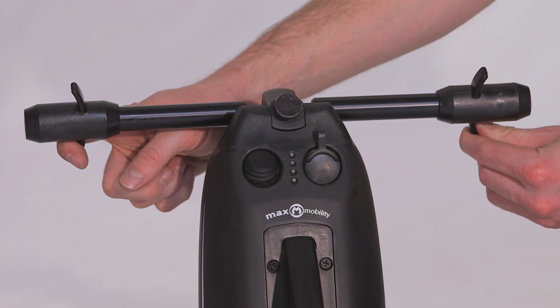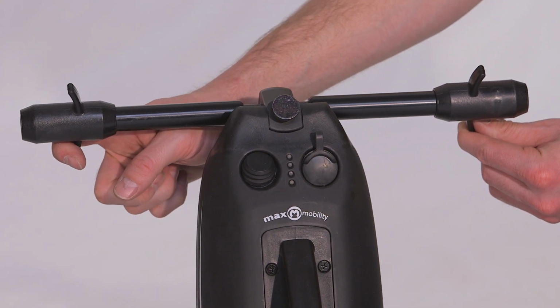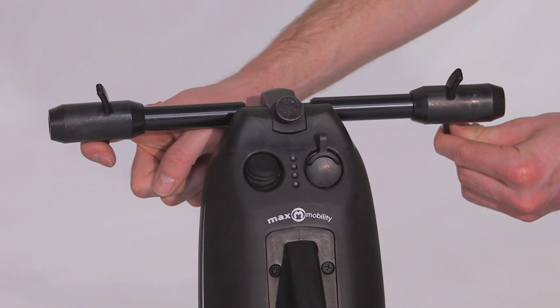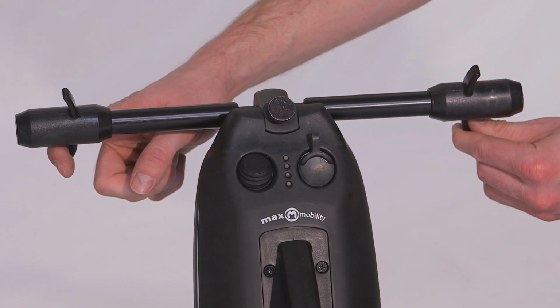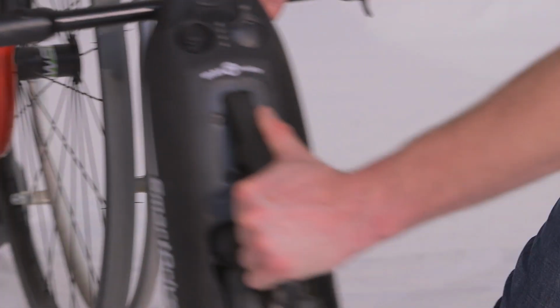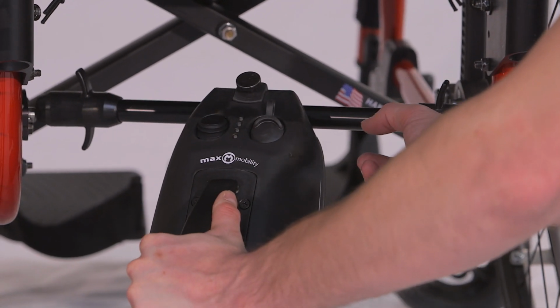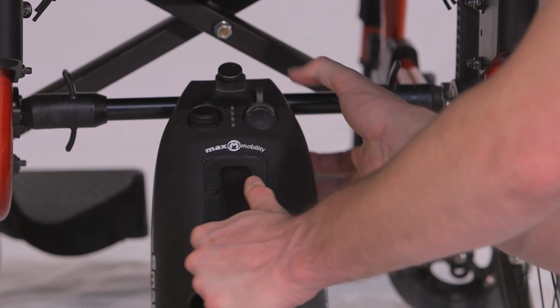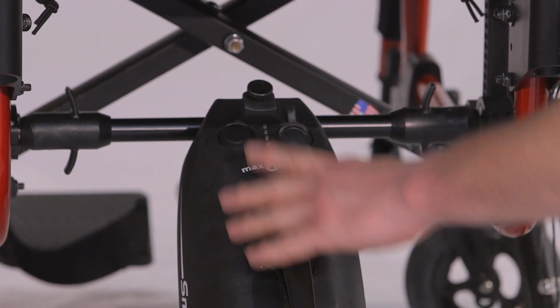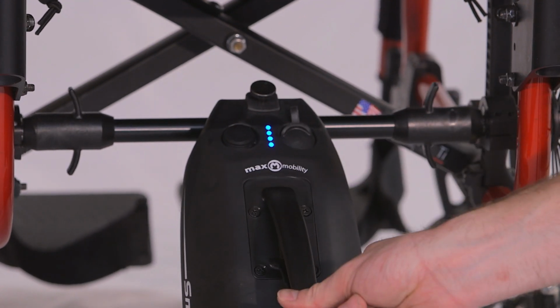With everything completely set up, the spring-loaded end caps can be compressed to allow for attachment clearance, and then released to be put over the axle tips. Whenever you're handling a drive unit, you'll want to be sure your wristband is turned off. For easiest attachment, it helps to position one end cap over the axle tip, then use the tabs on the other to compress and position it in place. The tension force of the springs constantly push out to prevent the adapter bar from coming off the wheelchair until you are ready to take it off.